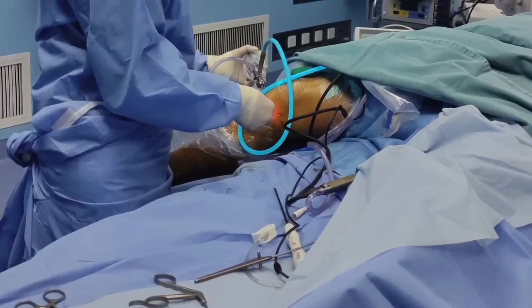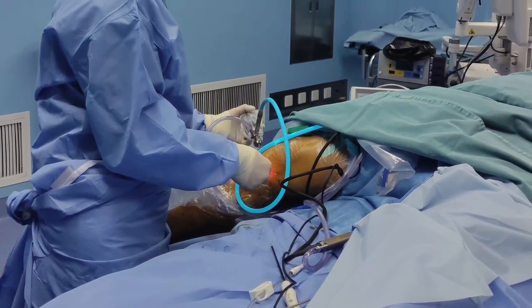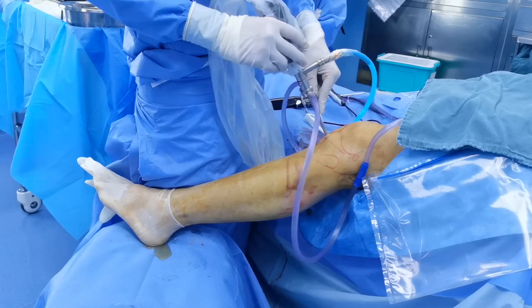More than four layers of sterile towels and waterproof sheets were placed on the metal stool. The foot was positioned on the stool for stability, allowing easy adjustment of the knee by altering the table's position.